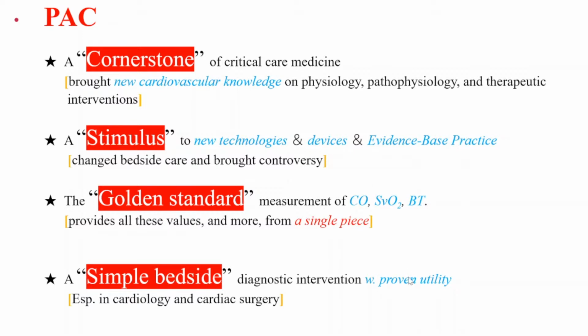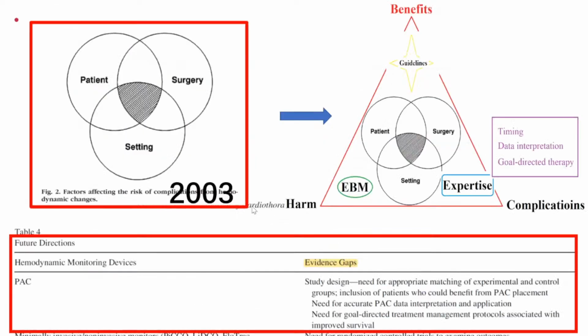Twenty years have passed since ASA published its guidelines for PAC. New evidence has accumulated, and many doctors have gained experience with PAC use. In order to maximize the benefits of PAC use, mitigate the harm, and minimize the complications of PAC, a lot of work needs to be done in the future. Thoughtful patient selection, judicious use of the device, and many evidence gaps need to be filled.